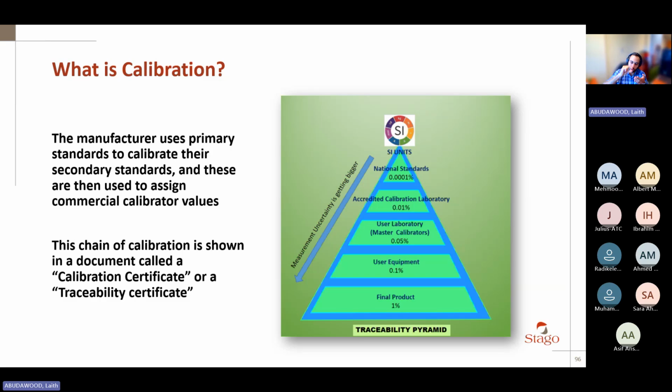You take this new calibrator that you made in the national calibration laboratory, take it to the manufacturer. The manufacturer machine is not 100% accurate. It adds a little bit of error. You take this calibrator you produce in the manufacturer lab, you run it in the lab itself, the customer lab. The machine in it is not 100% accurate. So this adds even more error on top of the error that came with the calibrator already.